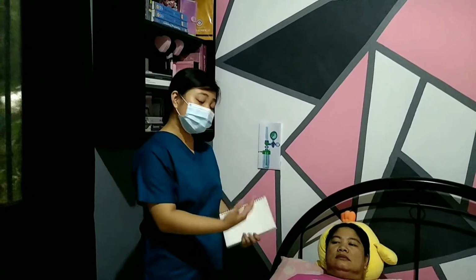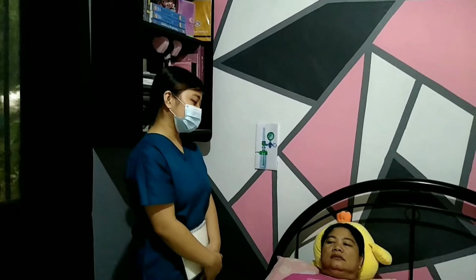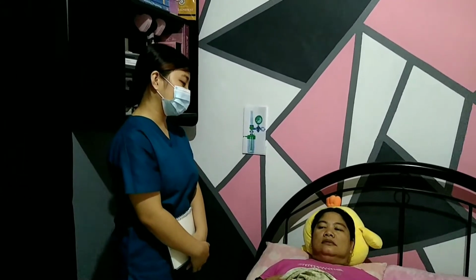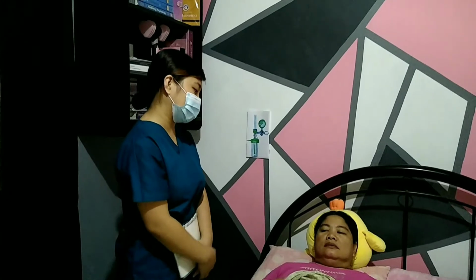And the goal of this therapy is to maintain normal hemoglobin saturation so as to facilitate normal oxygen delivery to peripheral tissues. Next, explain the procedure to your patient and to the family or significant others, the procedures that you are going to do to your patient. And then lastly, you need to gather all the equipment that you are going to use and complete necessary charges.